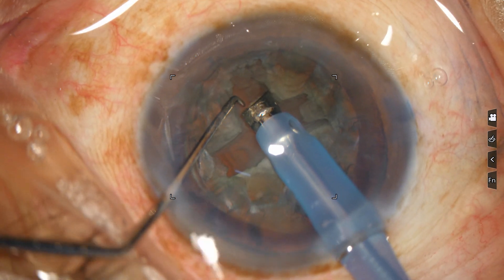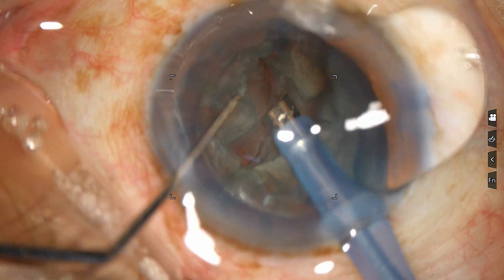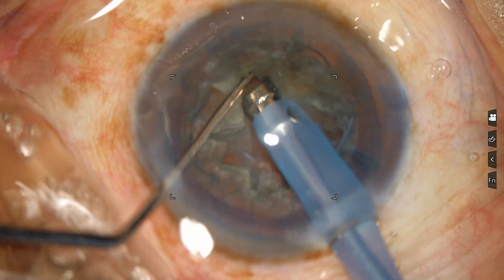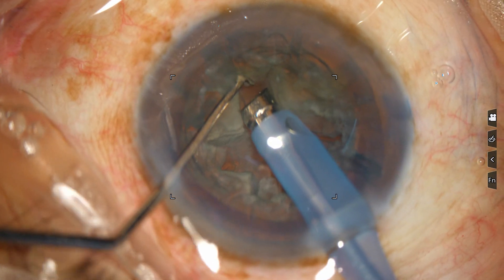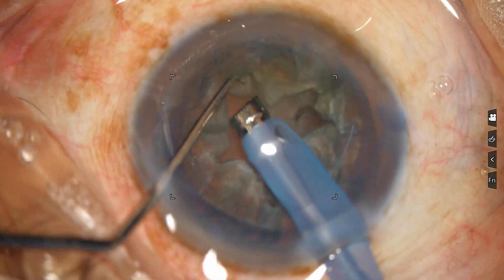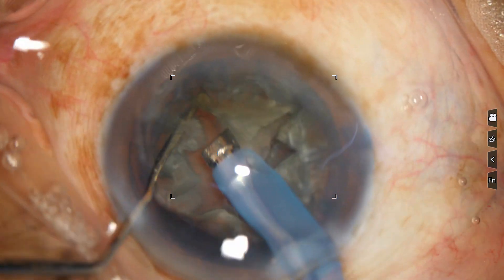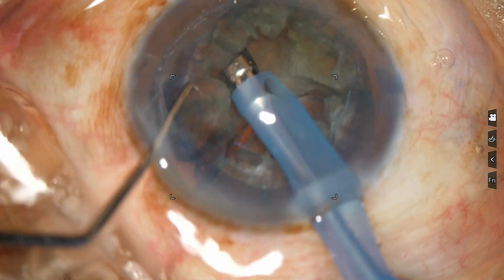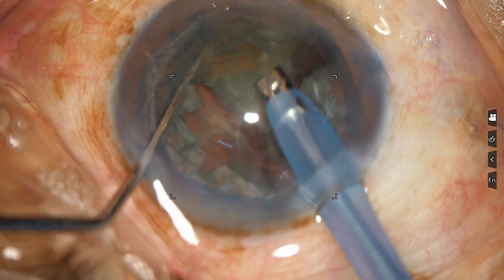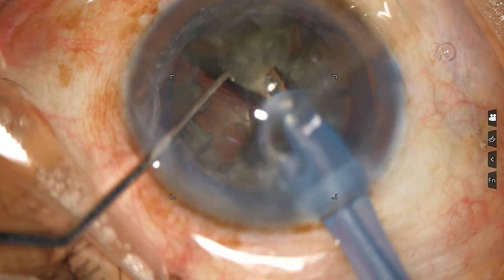Engage at the floor and do deep lateral separation. Use irrigation — not aspiration — just irrigation to maintain the anterior chamber. Engage at the floor and apply deep lateral forces. Now go to phaco mode. Fako 3. Start emulsifying.